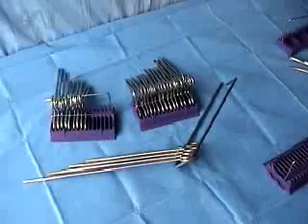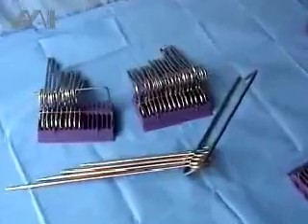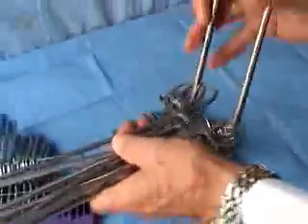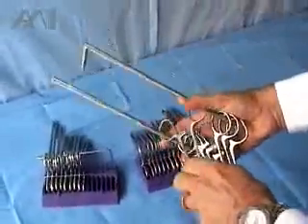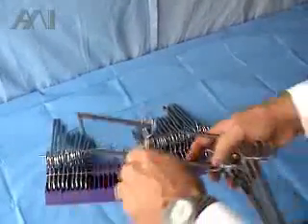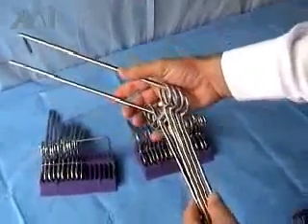I would like to explain and display our instrument counting and organization system. This system replaces the standard stringer, which is a very time-consuming and lengthy operation to thread every instrument into the stringer one by one. Our system eliminates that.